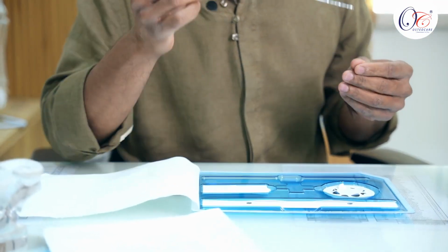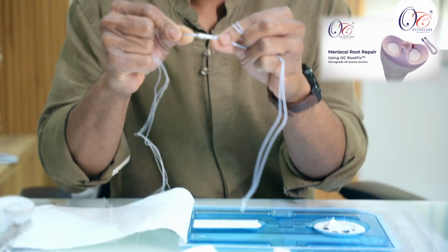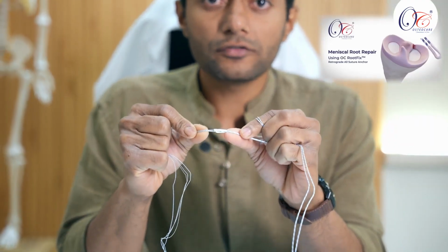This is a 2.3 mm drill bit, with which we drill a tunnel in the tibia, and this is the actual anchor. This is an all-suture anchor of 2.3 mm diameter, and these are the suture materials which are used to take bites in the meniscal root and also to repair it. This is again suture material which is used to pull the anchor into the drilled hole. All of these are made of ultra high molecular weight polyethylene, also called fiber wire material.